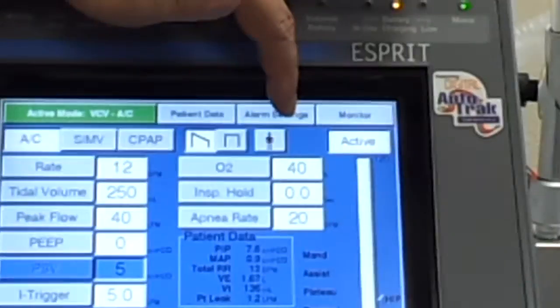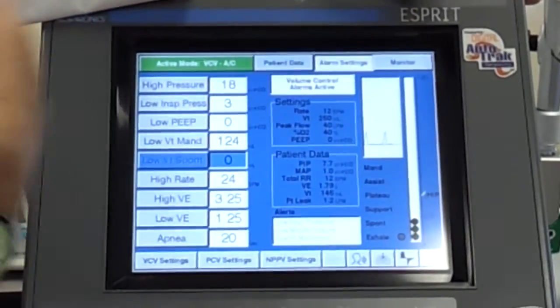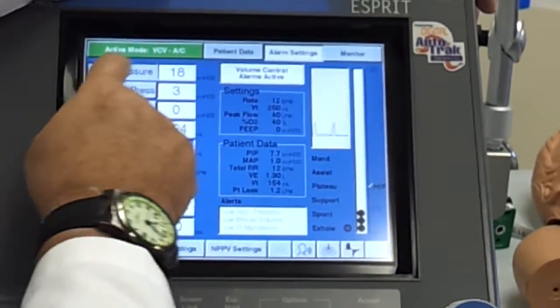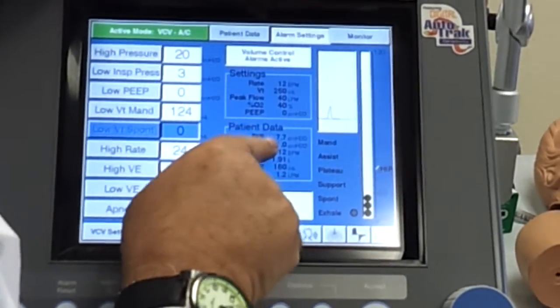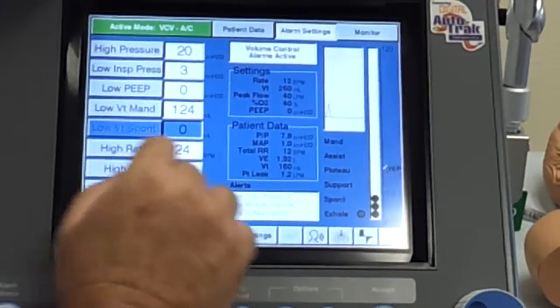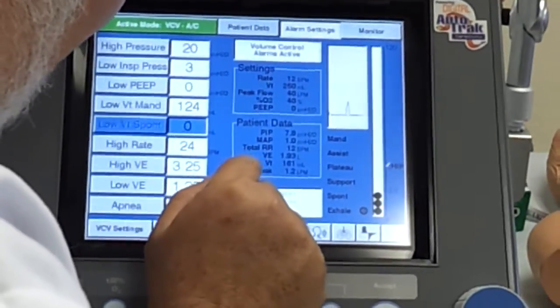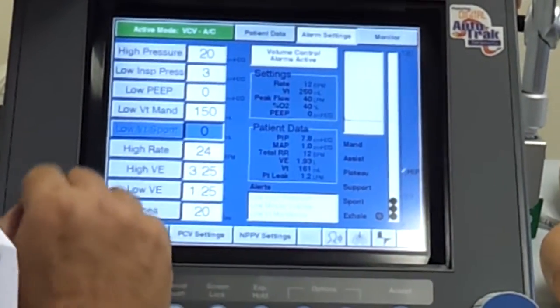We hit our alarm settings, and it's asking for high pressure. We know that when we set high pressure alarms, we set them 10 to 15 above our peak inspiratory pressure. We look down at the patient data and see that our peak inspiratory pressure is 8. So 10 above 8 would be 18 — I'm going to round it off to 20. So our low pressure would be 10 to 15 below, which would be negative. We can't go that low — the lowest the machine lets us go is 3, so we're going to say 3. Now we have no PEEP, so we'll set our low PEEP alarm at zero. Low mandatory tidal volume: we're giving him 250, so we want our low tidal volume to be 150.